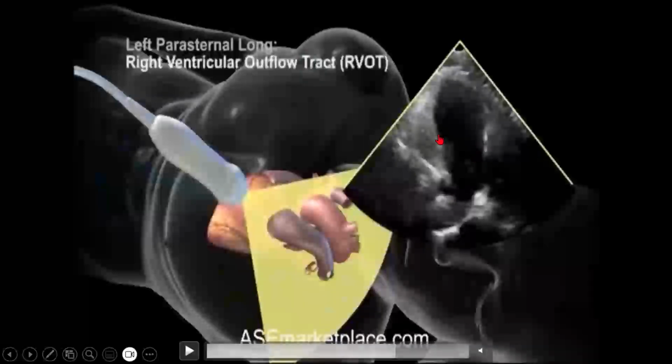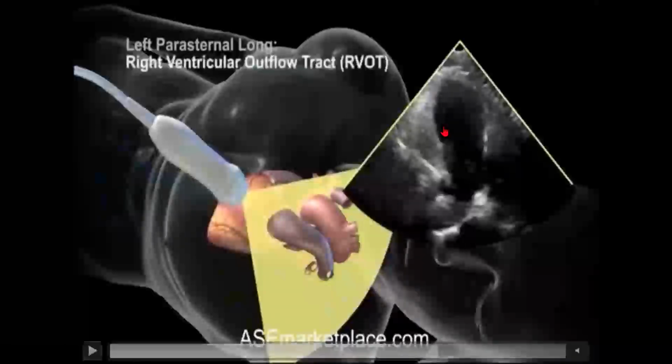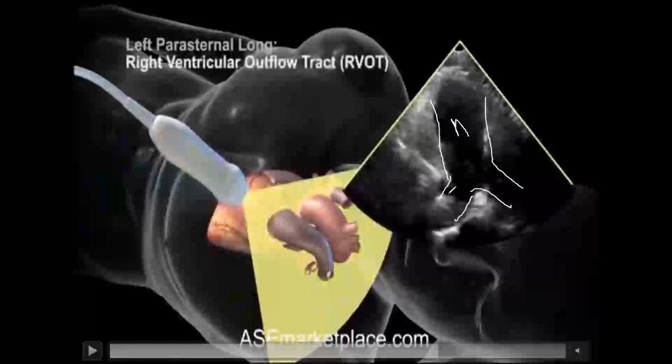Instead, you start seeing a vessel vertical to the aorta, coming from up to down. So this is your main pulmonary artery, MPA. And here you see this is getting divided into two branches. So this is your MPA, this is your RPA, and this is your LPA: main pulmonary artery, right pulmonary artery, and left pulmonary artery.